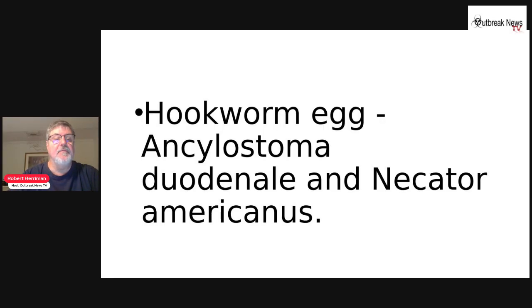It could be from the species Ancylostoma duodenale, the Old World hookworm, or Necator americanus, the New World hookworm. You cannot differentiate the genus and species based on the appearance of the egg. With this type of parasite, finding the larval stage in feces can also be diagnostic.